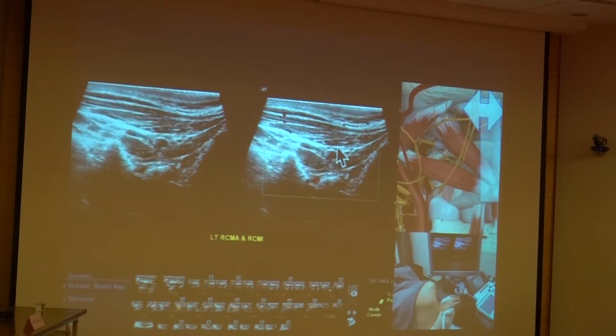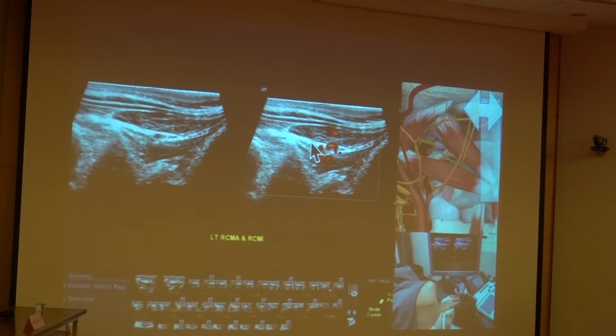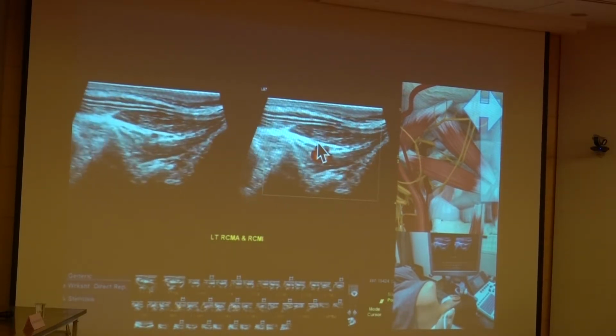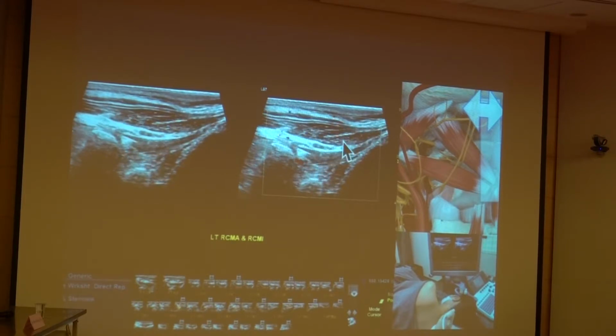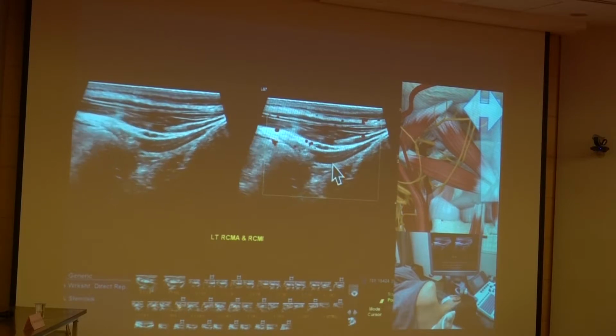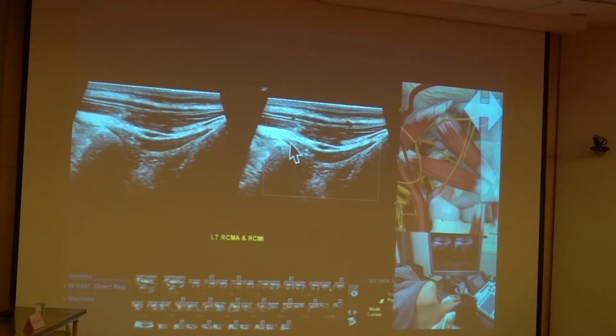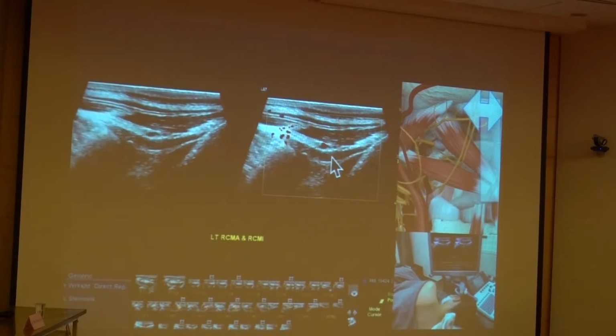And at this level, the fascial layer on top of the rectus capitis posterior major, you are seeing the greater occipital nerve, the lesser occipital nerve, and the third occipital nerve. It's basically really over this fascial layer, and the semispinalis capitis on top of it, and the upper trapezius. And if I go more medial, this time you can see that after seeing the spinous process, one of the bifid spinous process, you're seeing the rectus capitis posterior major, and the minor is really coming from the occiput all the way to the C1.